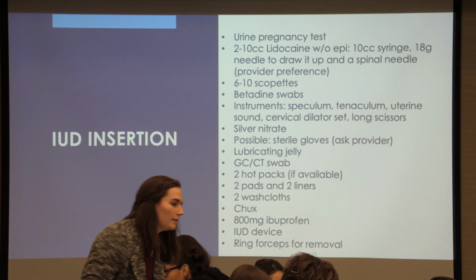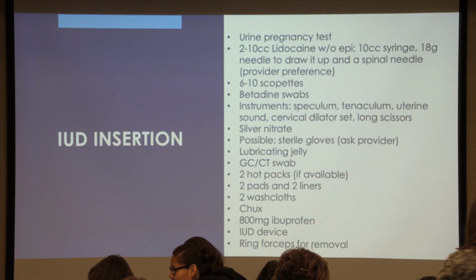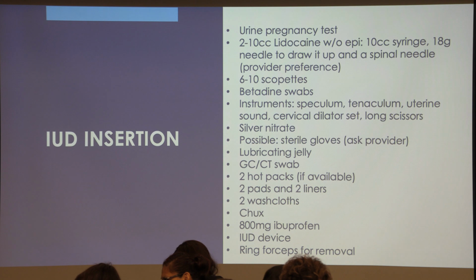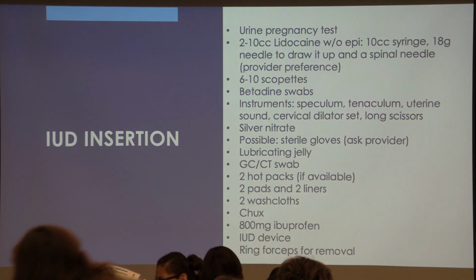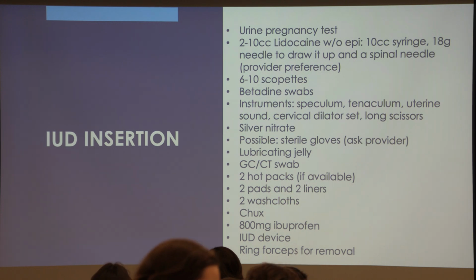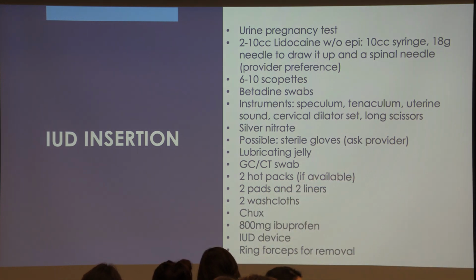we'll just begin by looking over the IUD insertion and our instruments, our tools, supplies needed for that. So we always like to start off with our urine, getting a urine HCG pregnancy test. We typically like to have lidocaine. It is provider preference though. So anywhere from 2 to 10 cc's of lidocaine, typically without epi. You need a 10 cc syringe, 18 gauge needle to draw up the lidocaine, and then we use what we call a spinal needle, a 25 gauge, 1 1/2 inch. Scopettes are needed, betadine swabs, and then our instruments that we use.